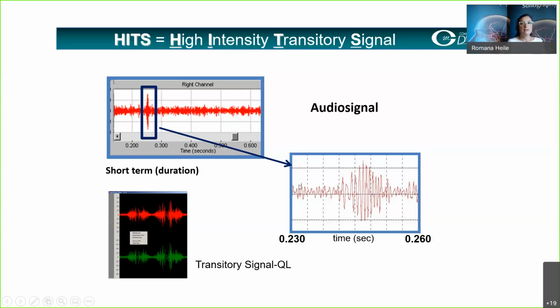If we stretch out the time scale of this event a little bit, then we can see the variations of the blood cells. It's oscillating, and this is oscillating as well because it's also moving within the bloodstream. So everything that's moving gives us this oscillating pattern, but the amplitude is much higher.